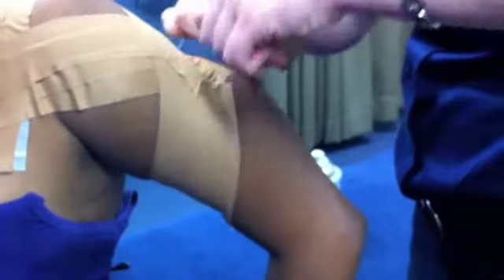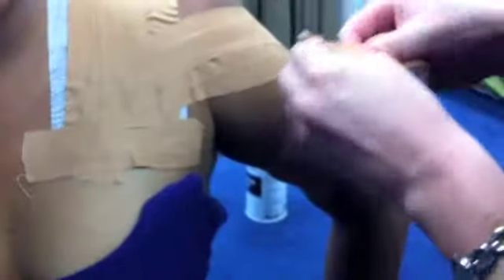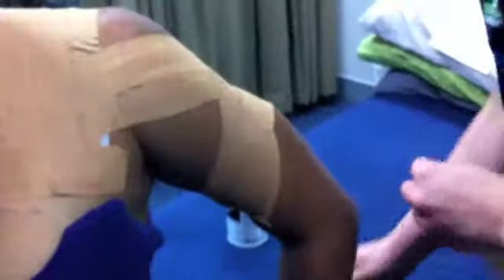To finish off, two anchors are applied to the end points over the pecs and the shoulder blade. After the technique is completed, the patient is asked to lift their arm to ensure the tape is comfortable.